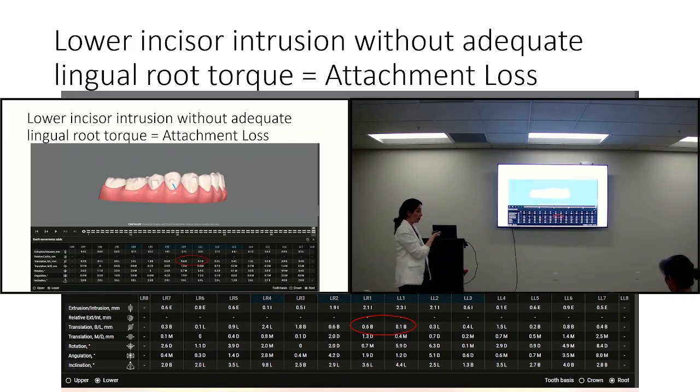So I will never make this mistake again because I learned from this mistake. There was nobody to tell me that this could happen, even though I went to orthodontic school. Nobody told me this, because Invisalign, this whole clear aligner treatment, is relatively new. And even when I went to school, my instructors didn't even know things like this could happen. Yeah. If you brought that back lingually, do you think you can regain some of that? And we did, and we got the attachment back, mostly.